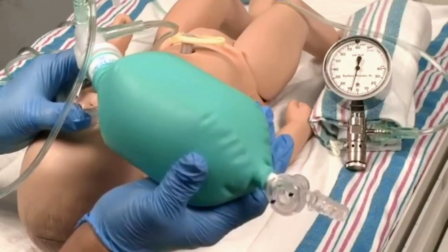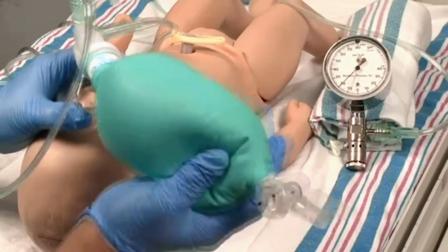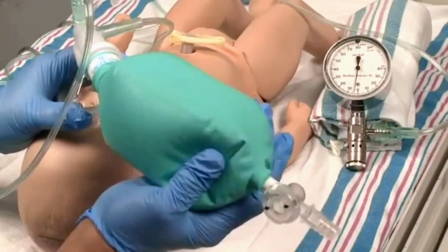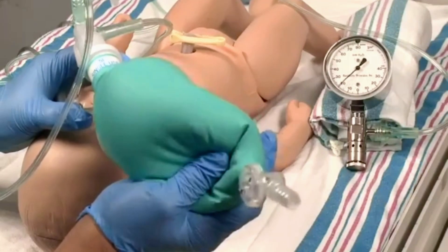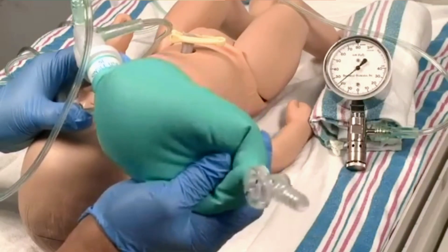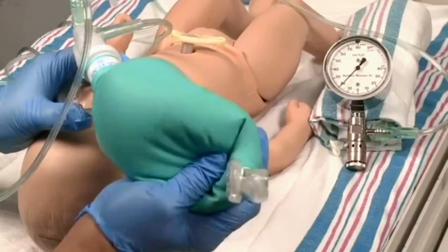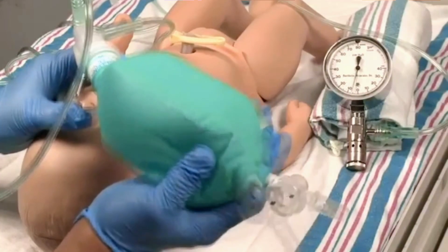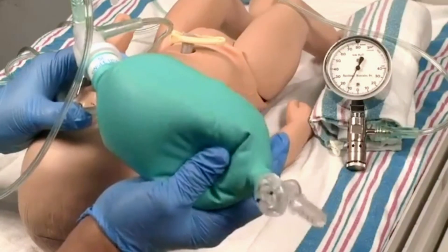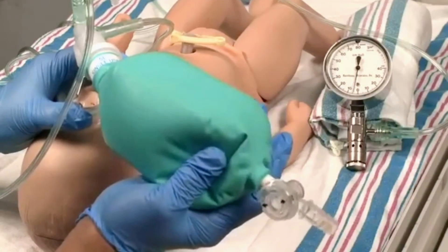The flow inflating bag is also called an anesthesia bag. A pressure gauge registers the amount of pressure being used to ventilate the newborn and helps you avoid excessive pressures. The pressure gauge measures the amount of inspiratory pressure when you give a breath, and can also measure the end expiratory pressure.